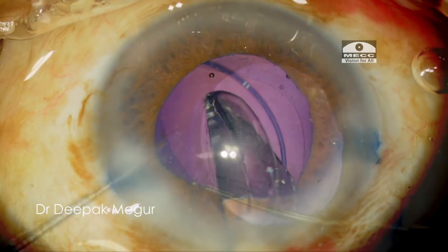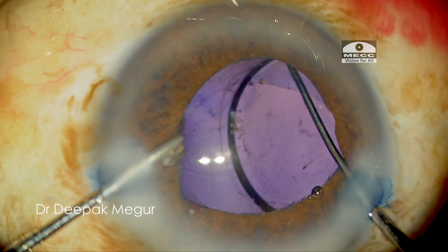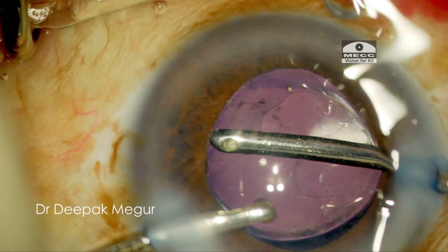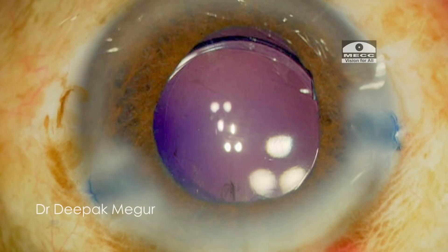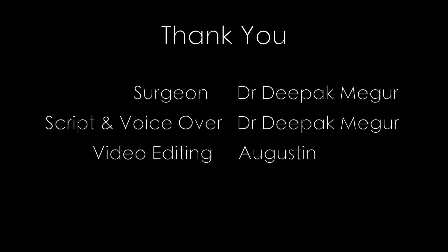The blue dye gets absorbed in a couple of days and the patient will not have any difficulty with visual recovery, so nothing to worry about. This case with the blue fundal glow is a reminder of how, in some eyes with generalized zonular weakness, fluids can traverse across the zonules. Thank you for your attention and hope this helps.